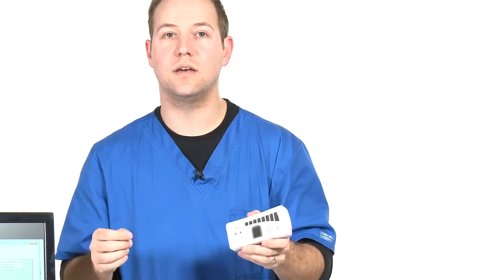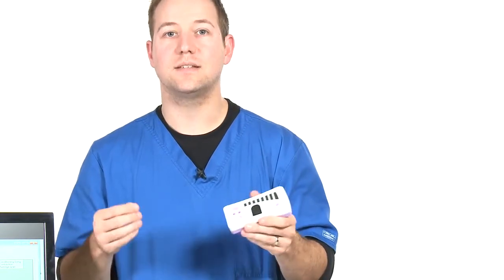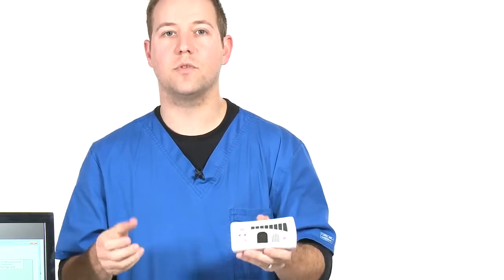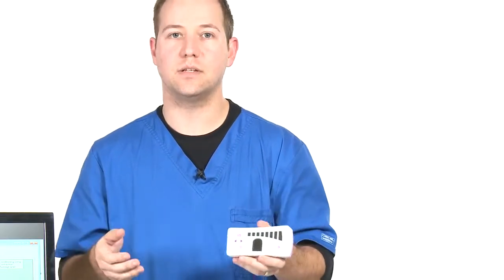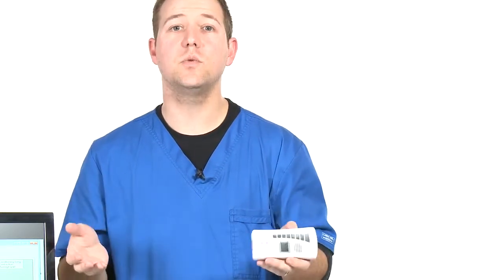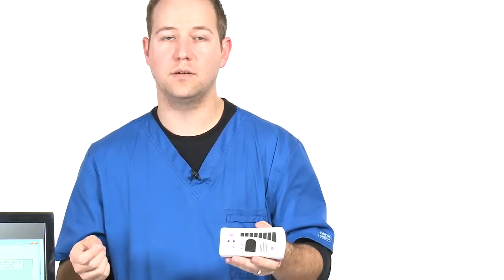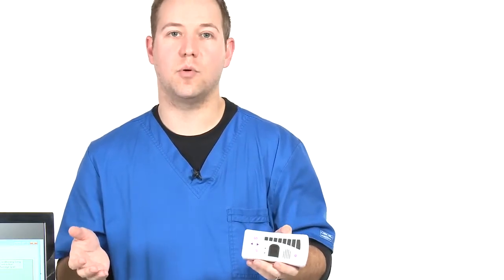If at the 2-week mark, the patient does not see abatement in their stress, urge, or mixed incontinence, make sure that the patient is not discouraged. This takes time. It took time for their pelvic floor to get into the shape that it's in currently and experience the leakage that they're experiencing currently, and it will take time to get those symptoms back in check. So essentially, at the 2-week mark, while it's wonderful if patients do note some slight improvement, they may not see any at that point at all.